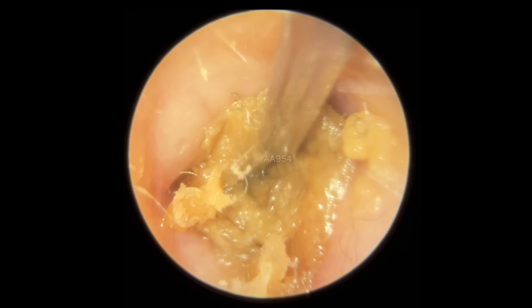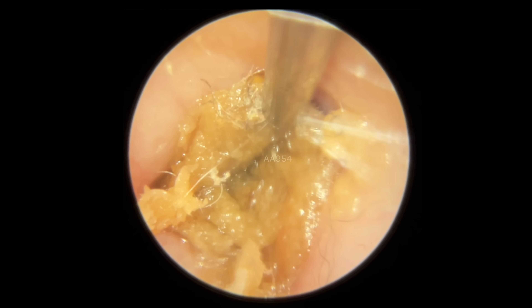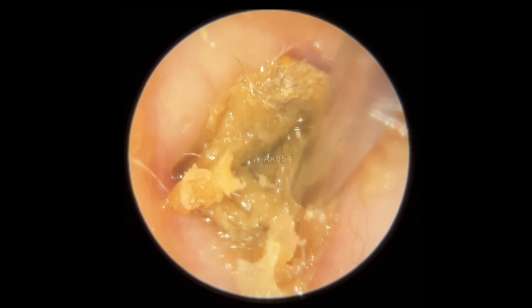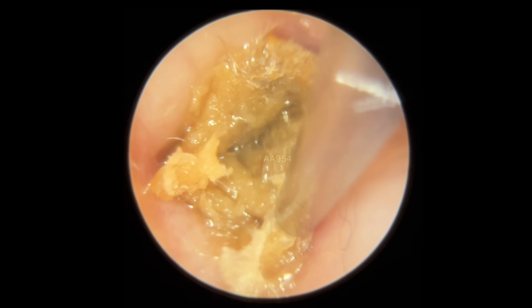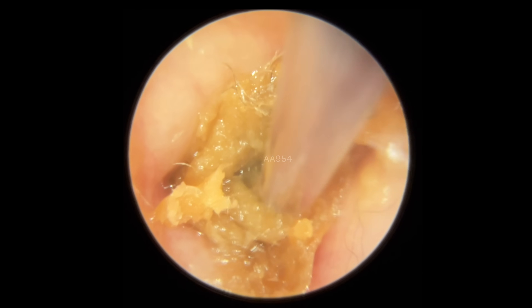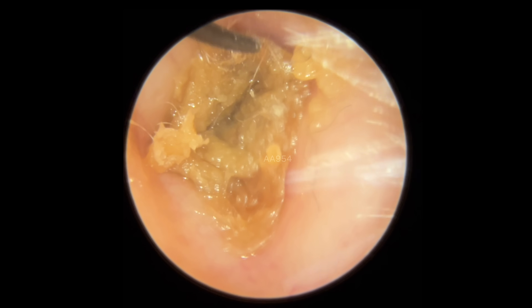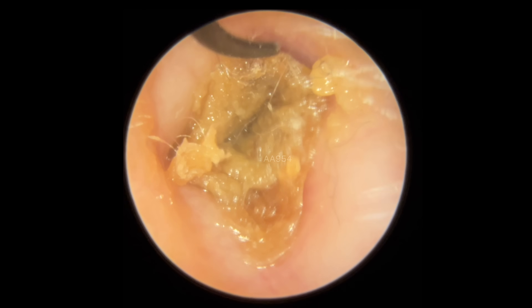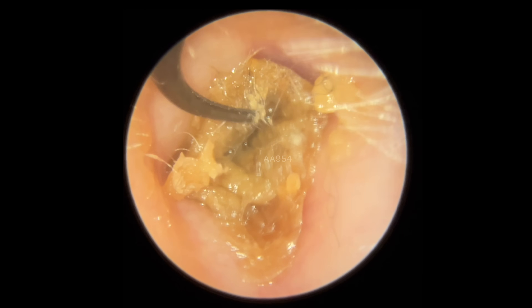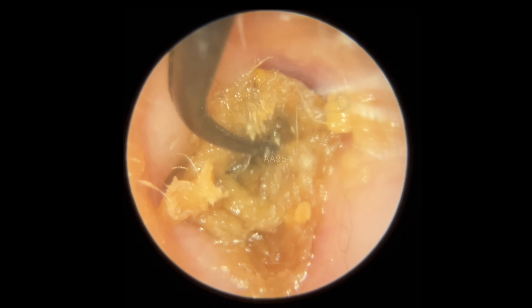Sometimes you'll get them — most of the time they appear in threes, though when it's a more advanced case that's not always the case. Nobody really knows the exact reason it happens. The most prevalent theory is that exposure to water — they used to think it was cold water specifically, but now they understand it's exposure to any water. As it evaporates off the skin it has a cooling effect, and that's what forces the body to lay down this benign bone. It can be problematic if the exostoses start to touch, or if you get wax and skin debris forming beyond them.